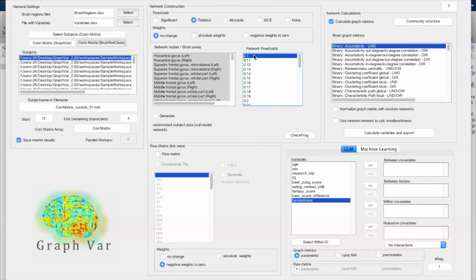And this is important because you do not want to compare, let's say, different groups if they have different sized networks or different amount of links, because this will then artificially give you different numbers in the network topological measures, which will just lead you to make false inferences about this. So this is the most commonly used method, actually.